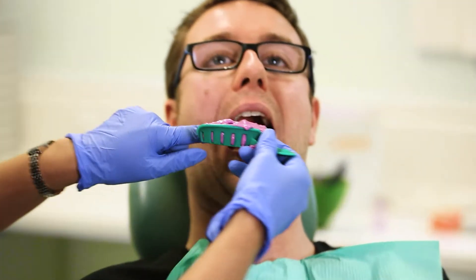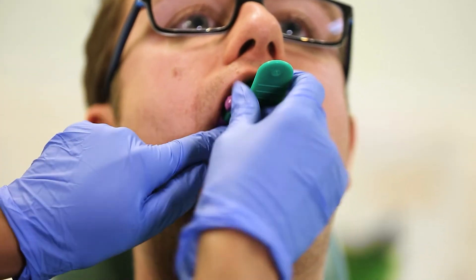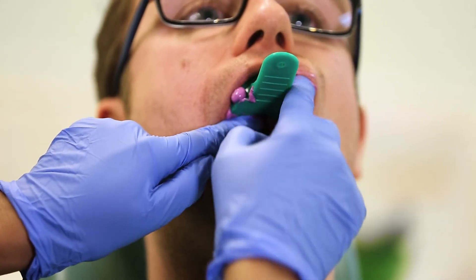After the retraction cord has done its work, your dentist will then have to take an impression or a mould of the tooth, or a scan of the tooth. This is to give the laboratory information about the shape of the tooth so that they are able to make your crown for you.